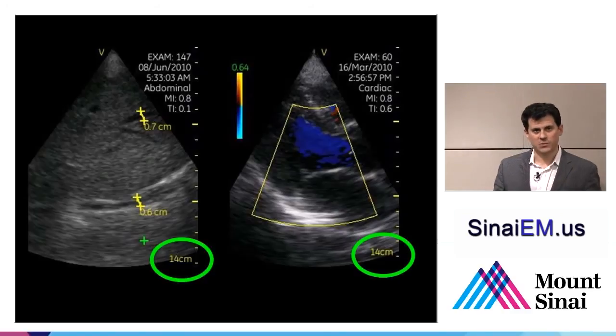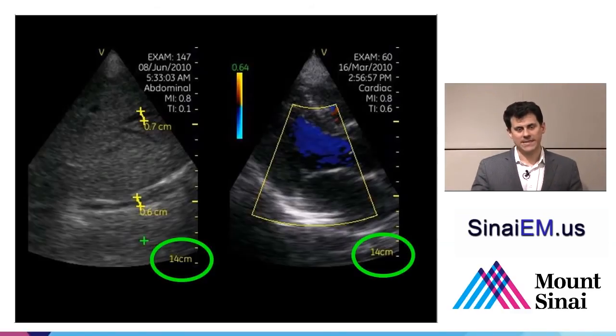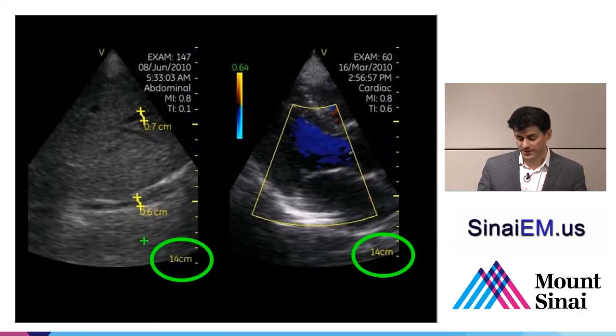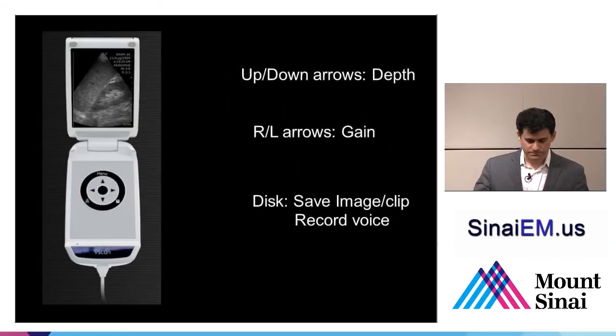It's generally best when you're scanning a patient to start off pretty deep, get a wide picture of what's going on, and then close the gap and start to change your depth so that you're only seeing what you want to see. Starting off too small sometimes causes you to lose sense of what you're actually looking for, and you'll misread what structures are. So starting off really big, with a wide berth, and imaging your structures a little too small at first is better, because then you can make those images look bigger as you need to.